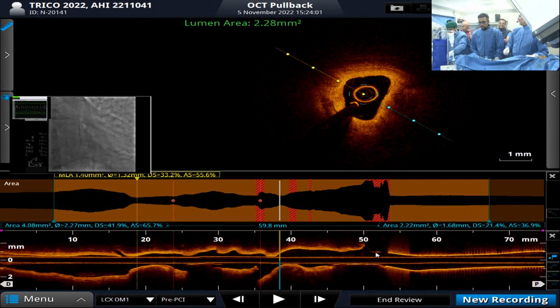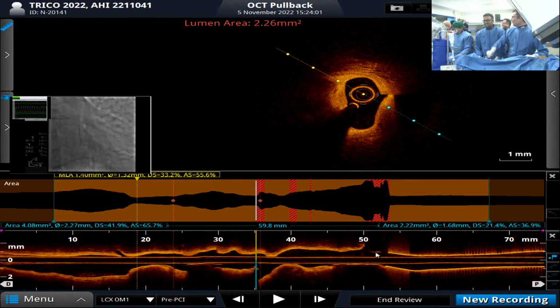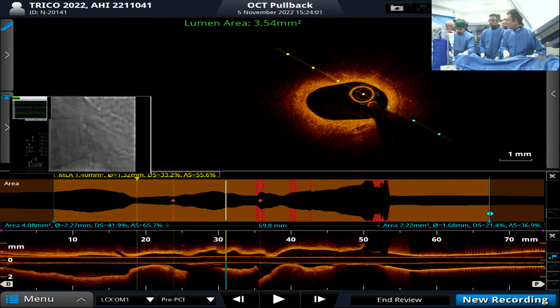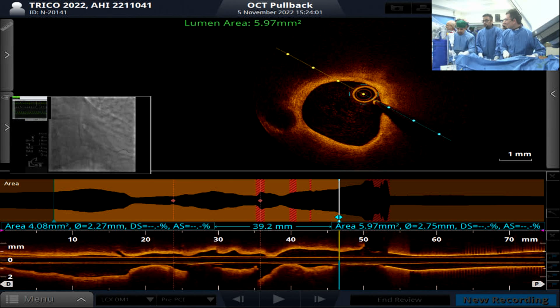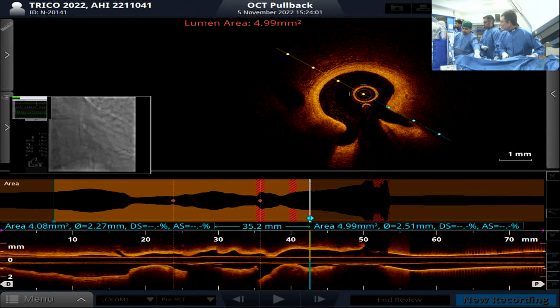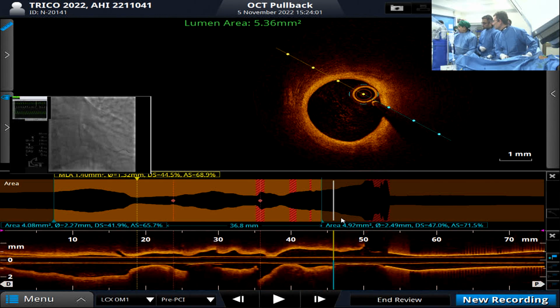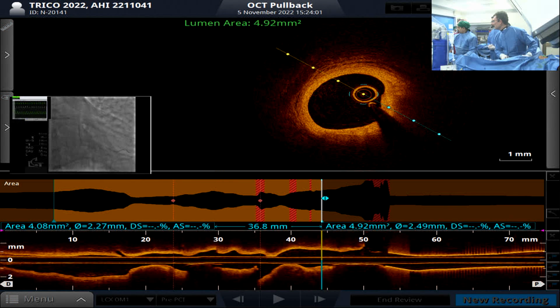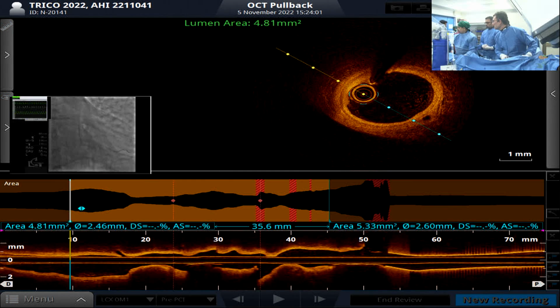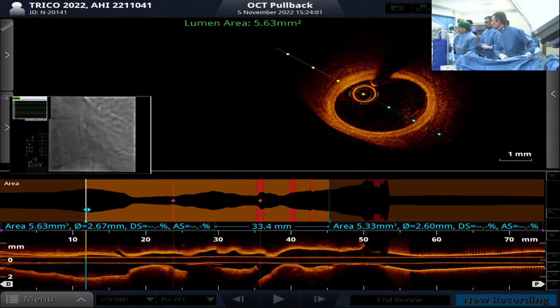Okay, that's nice. And because Dr. Rajiv said non-compliant, I'll use a compliant balloon. So what's the lesion length that you evaluated there? Taking the lesion length. Yes, this is a good area. No, come back. And what's the size? That portion is an ideal landing, right? So what lesion length do you have there? 2.6 in lumen diameter, therefore 2.75, right?